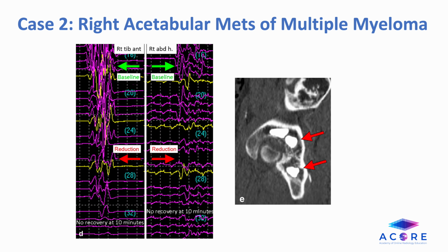Following the decision to not attempt the additional freeze cycle, the balloon-assisted cementoplasty, shown in the red arrow on the right side picture, was performed, and post-procedurally, the patient reported right lower extremity weakness. But it did not impact the mobility, and he recovered to baseline within 1 week. The patient's right hip pain surprisingly improved to 0 to 3 out of 10 at 1 week follow-up.